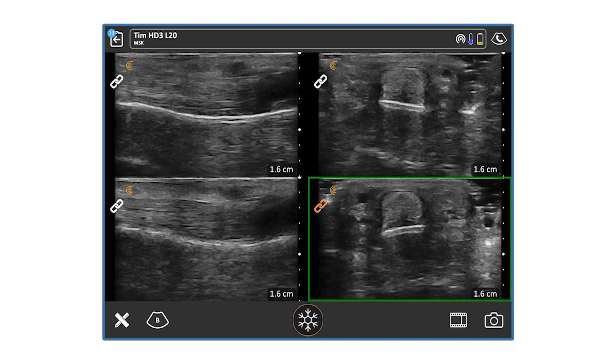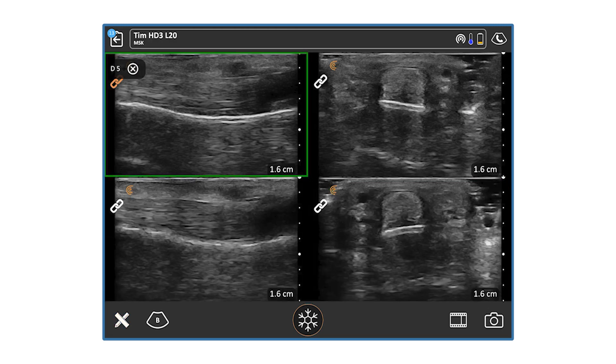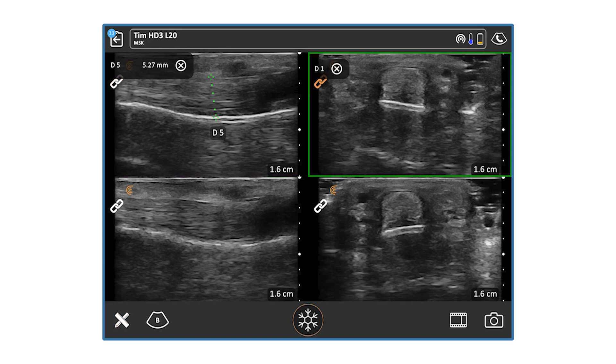Now that we have these four split-screen freeze-framed images, we want to compare and contrast and show the climber what's going on — longitudinal and transverse in one hand compared to the other — and see if there are any differences in bone-tendon distance. I'll select the top-left image, select the distance parameter, and measure from Point A on the bone to the top of the flexor digitorum superficialis in the longitudinal view on the right middle finger. Then I'll compare that to the transverse view on the right middle finger, selecting the distance tool and measuring from the bone to the top of flexor digitorum superficialis.